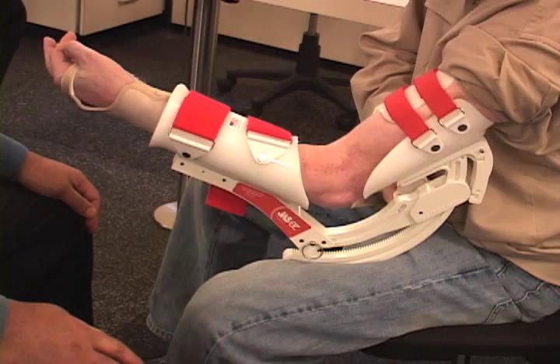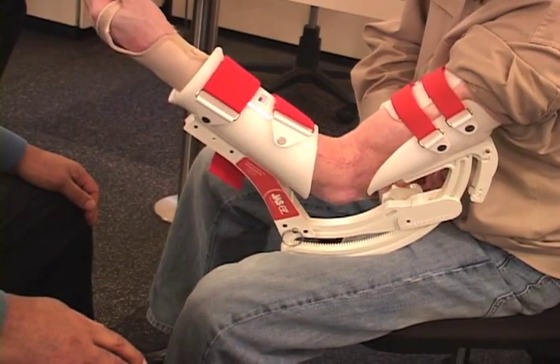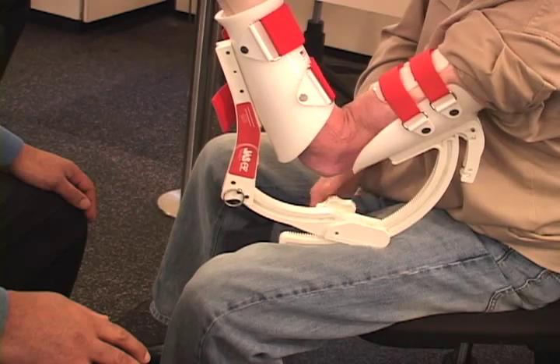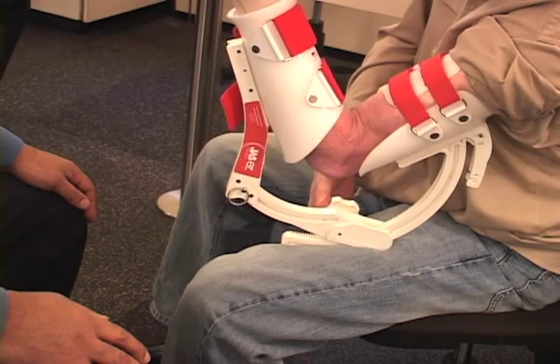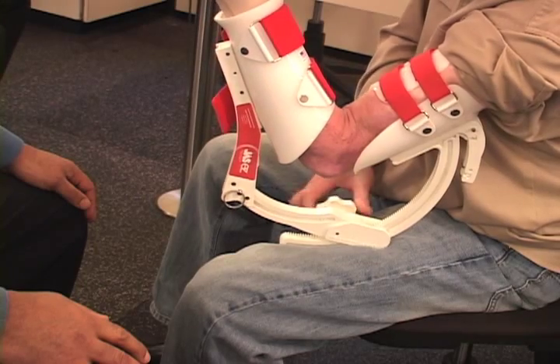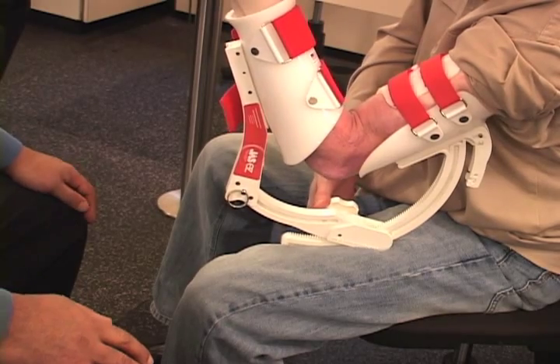He would turn the crank on the device. The device would bend the elbow up to a certain point. He would feel a slight stretch and sit there for five minutes. If the stretch that he is experiencing diminishes, then he would tighten the screw a little bit more, increasing the motion in the device until he felt another slight stretch, and hold that for an additional five minutes.